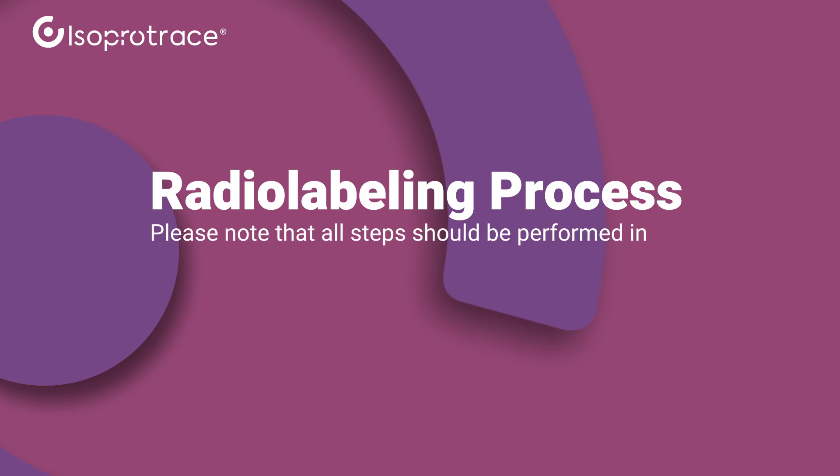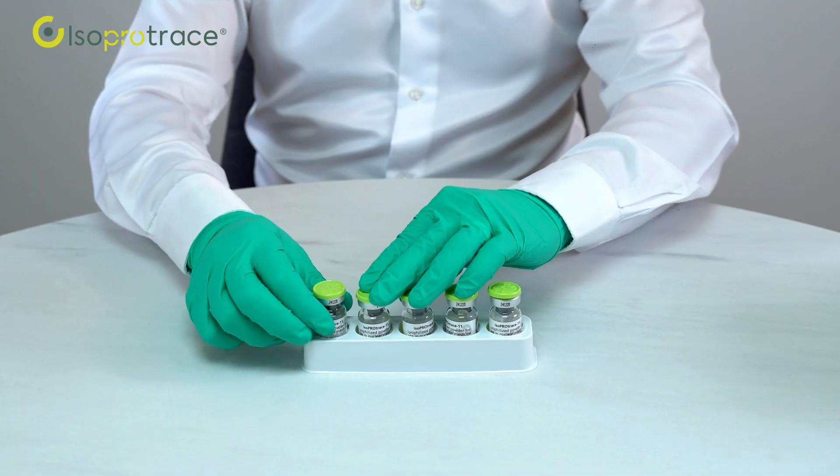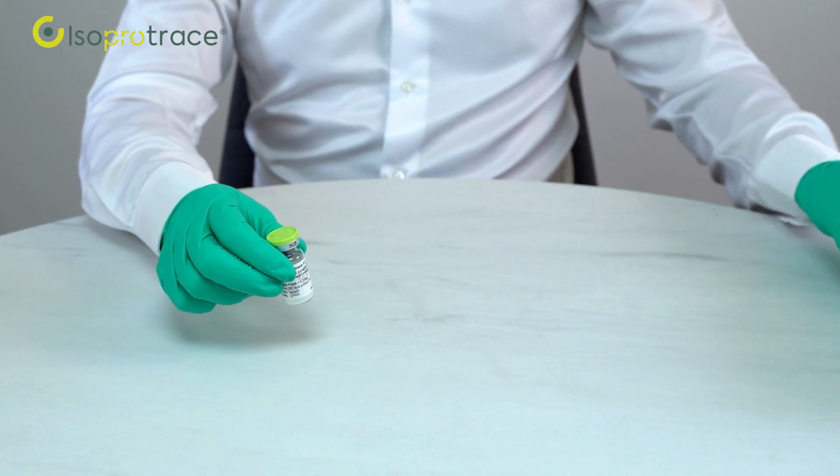Before we begin, please note that all steps should be performed in compliance with aseptic and radio protection rules. Before use, bring the vial to room temperature.